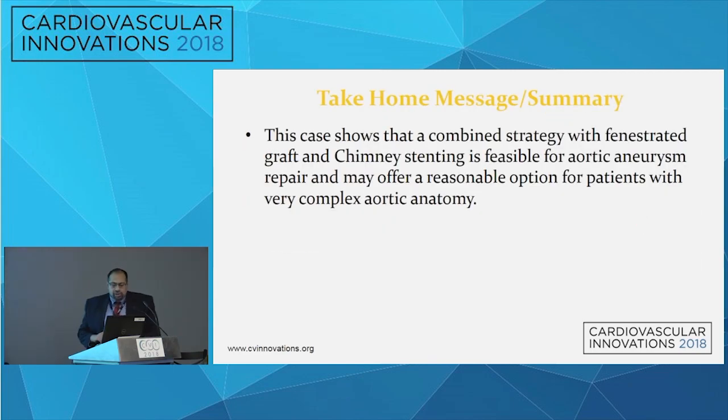So the main reason why I wanted to show this case is that people think about these two strategies, using fenestrated grafts or snorkel strategies, as competing strategies, but in reality, you can combine these strategies in cases that require that, and this case is a good example of that.